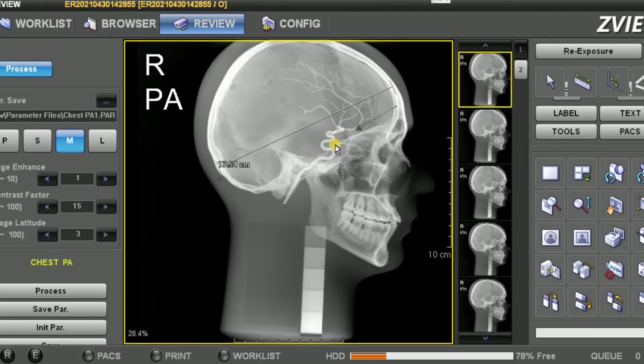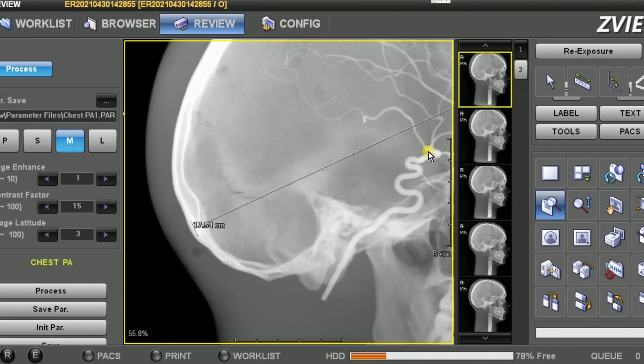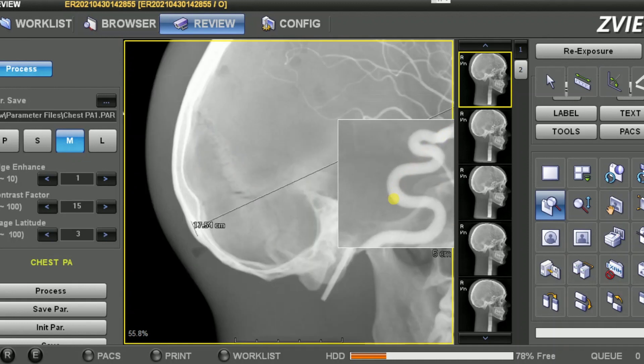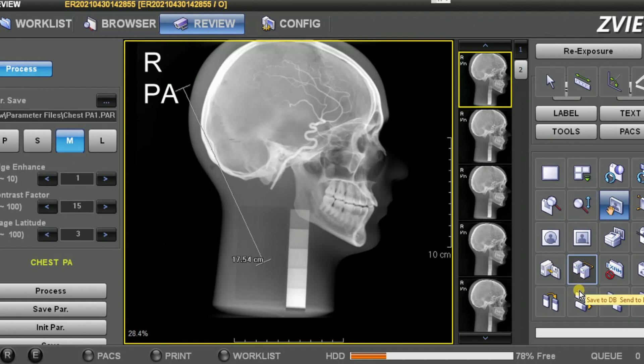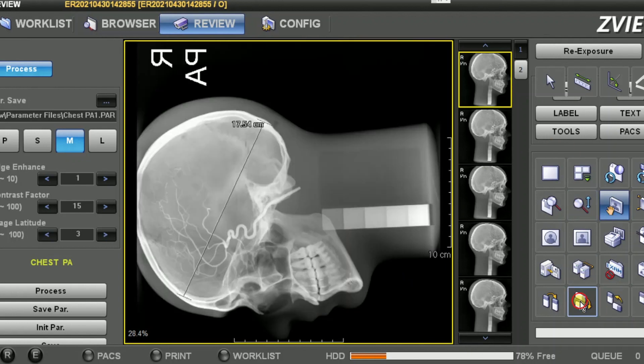Once you've acquired the image, you can use any of the available tools offered by your DR workstation provider. Depending on the DR software you're operating, you can then wirelessly transmit the images to PACS, download as a JPEG or onto a hard drive, or send to a printer. There is no limitation on the Europa hardware — this will depend on the capabilities of your DR provider.